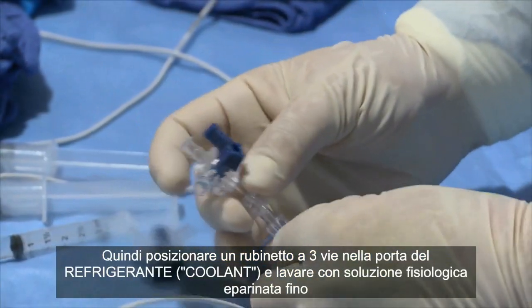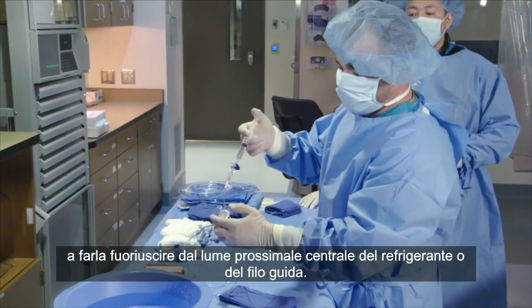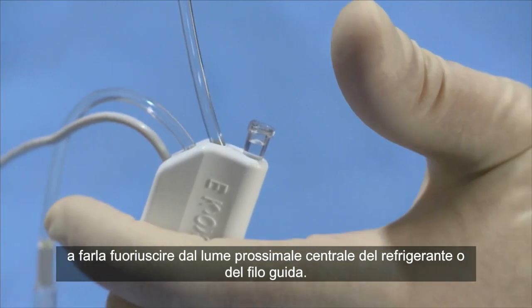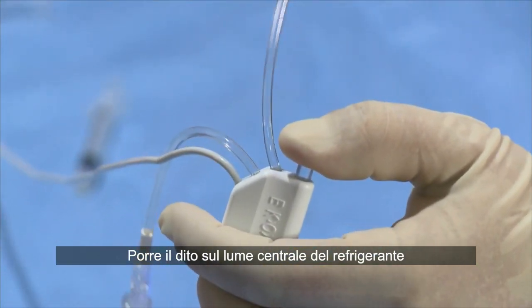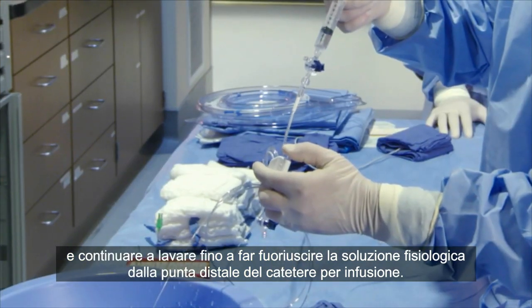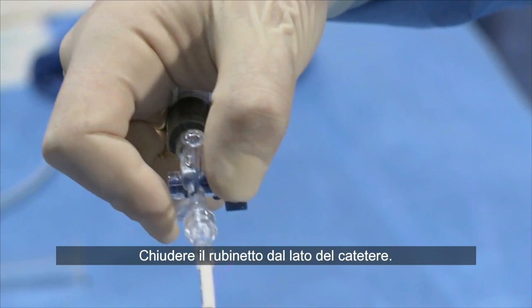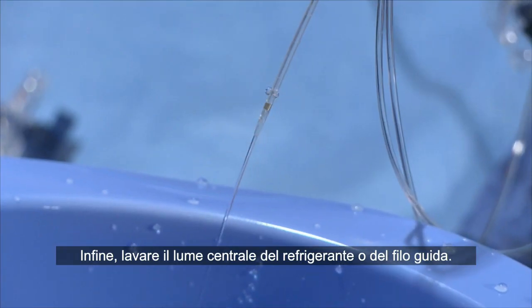Next, place a 3-way stopcock on the coolant port and flush with heparinized saline until saline exits from the proximal central coolant or guide wire lumen. Place your finger over the central coolant lumen and continue to flush until saline exits from the distal tip of the infusion catheter. Turn the stopcock off to the catheter. Finally, flush the central coolant or guide wire lumen.